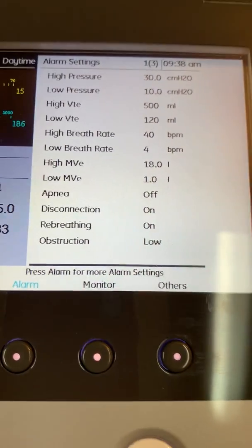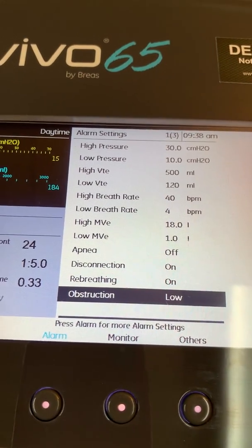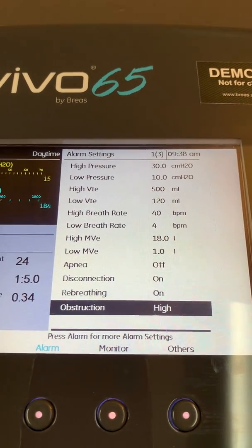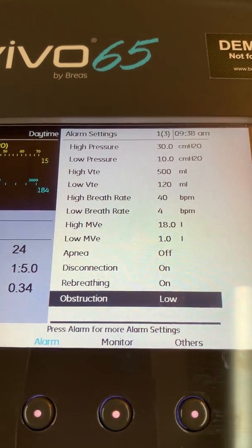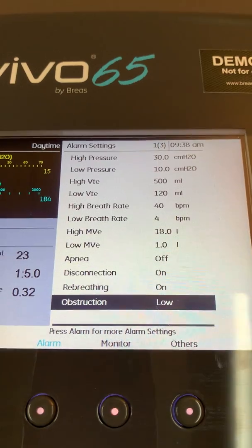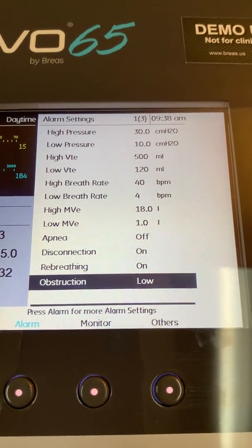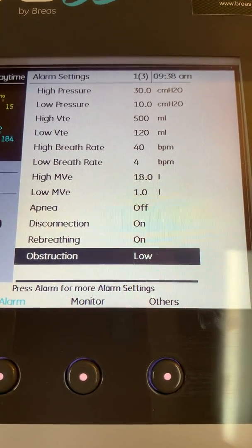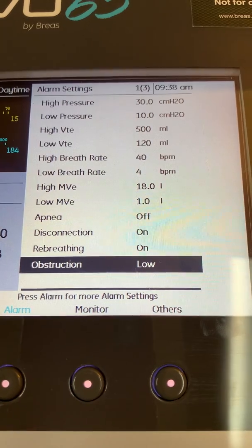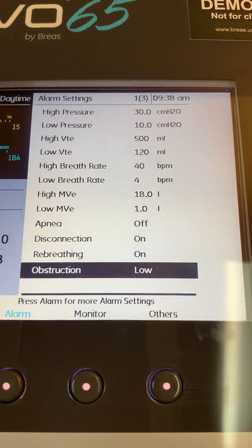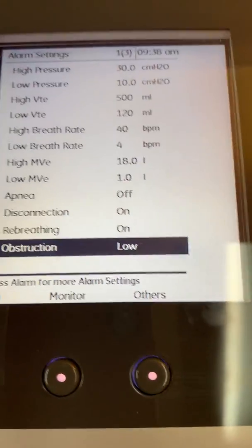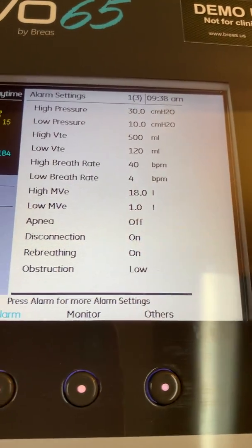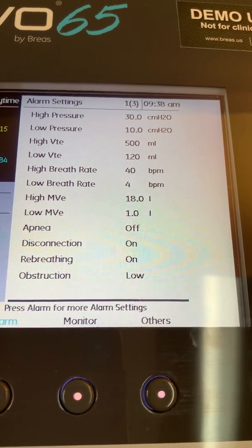The last alarm on page one is the obstruction alarm. There are three types of settings: off, low, and high. The obstruction alarm is activated in one of two ways. On the inspiratory side, the ventilator looks at a compliance calculation — if there is low compliance during the inspiratory phase of the breath, the obstruction alarm can be activated. On the exhalation side, if the tidal volume is below a specific threshold, the obstruction alarm will also be activated.